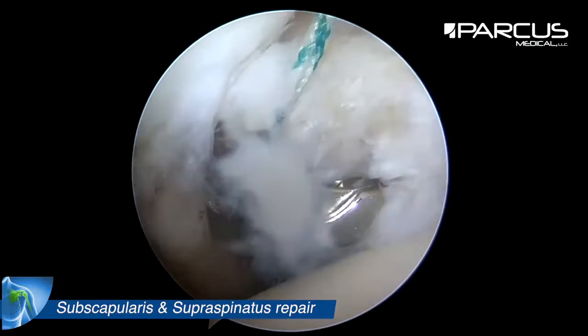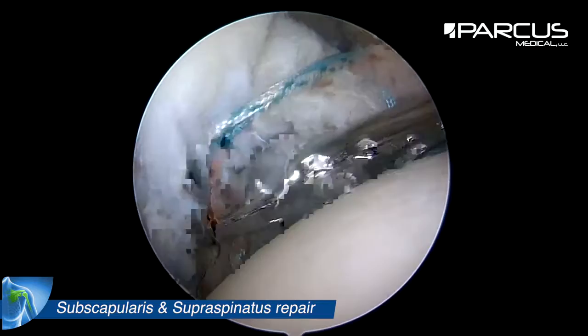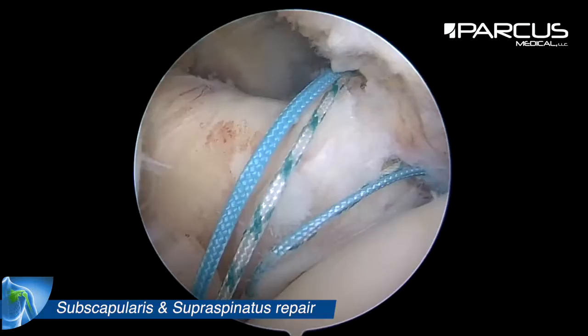Through the tendon we grab one strand at the lower part of the tear, then one strand of each suture in the middle of the tear, and then finally the last strand of the second suture at the top of the subscapularis.